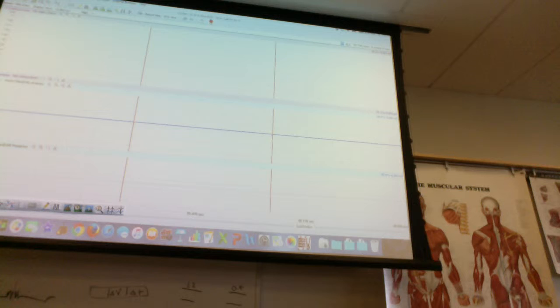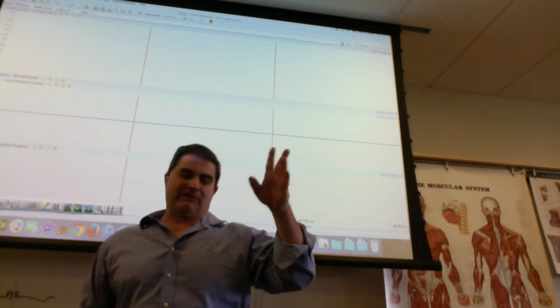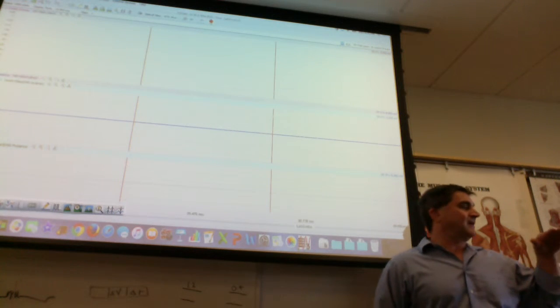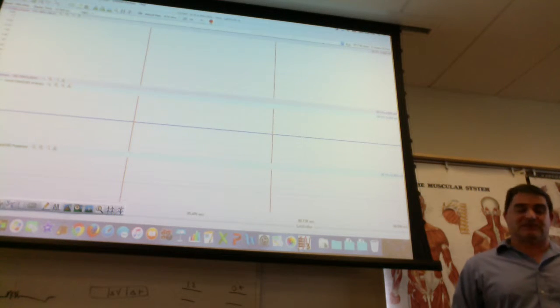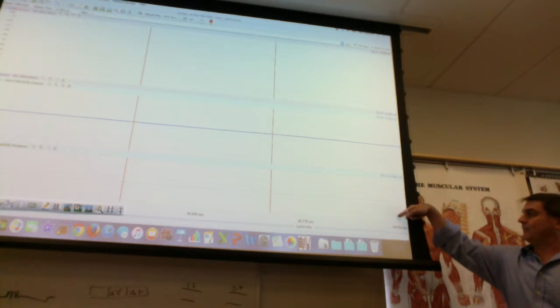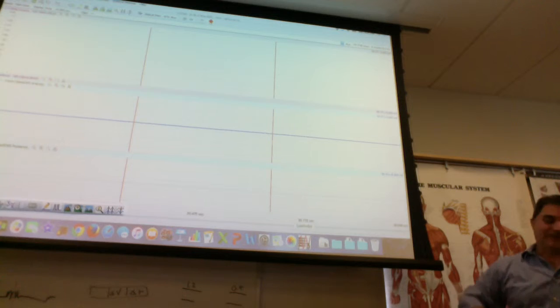Now there's going to be a lot of noise in those signals, so what I've done is I've applied a filter, and so if you look at everything around you that's electrical, it basically vibrates at 60 times a second. That noise can create a lot of interference. So I just remove everything that's occurring 60 times a second, I get rid of a lot of that noise. So these bottom two things are essentially the top two signals with noise removed, right?